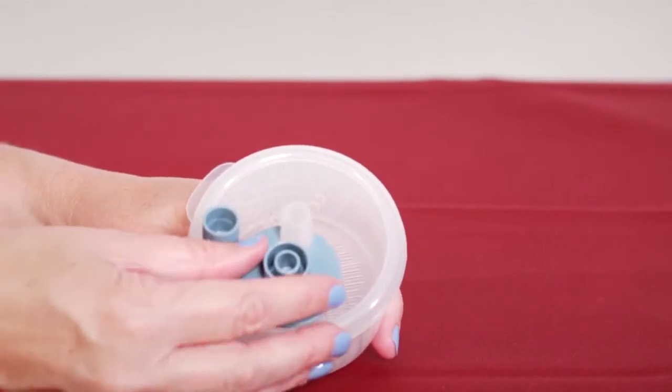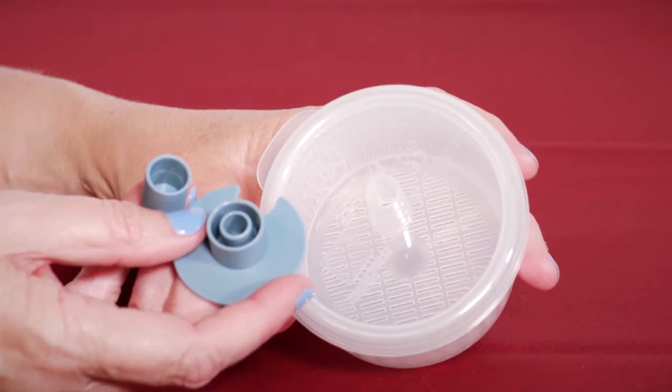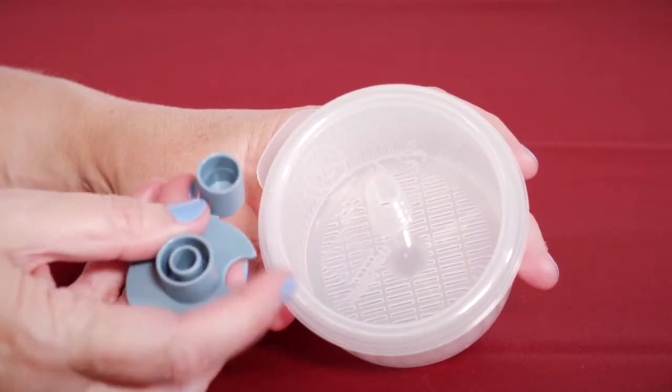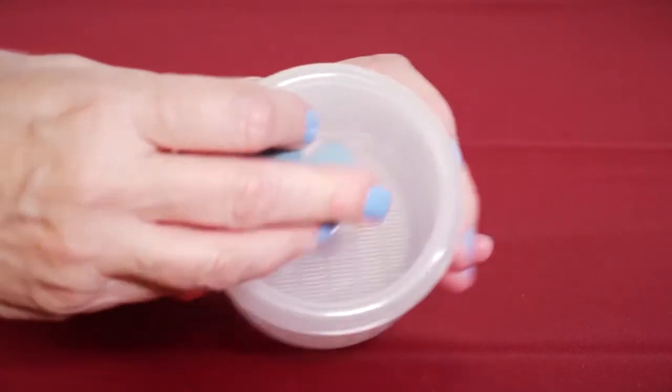All parts must be present, intact, and assembled for proper tissue specimen collection. The accessory sealing cap may be used to prevent specimen contamination at the end of the case.